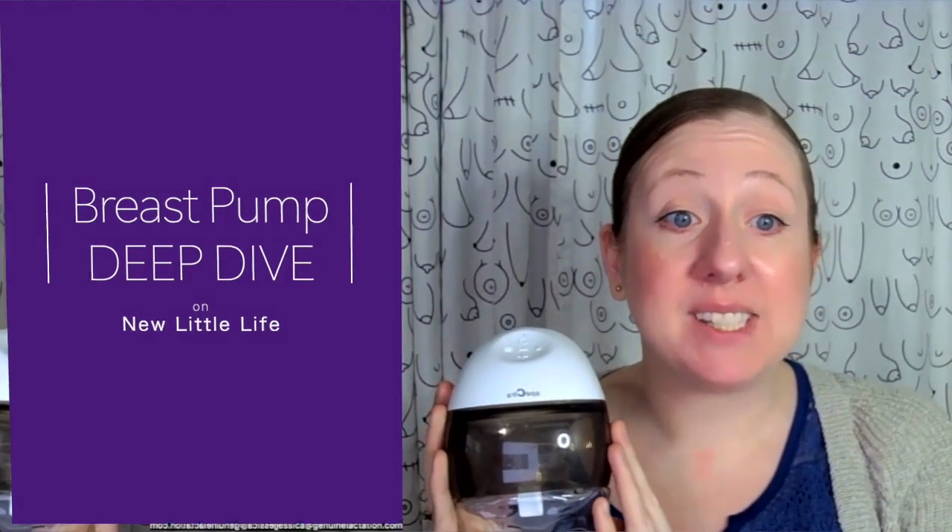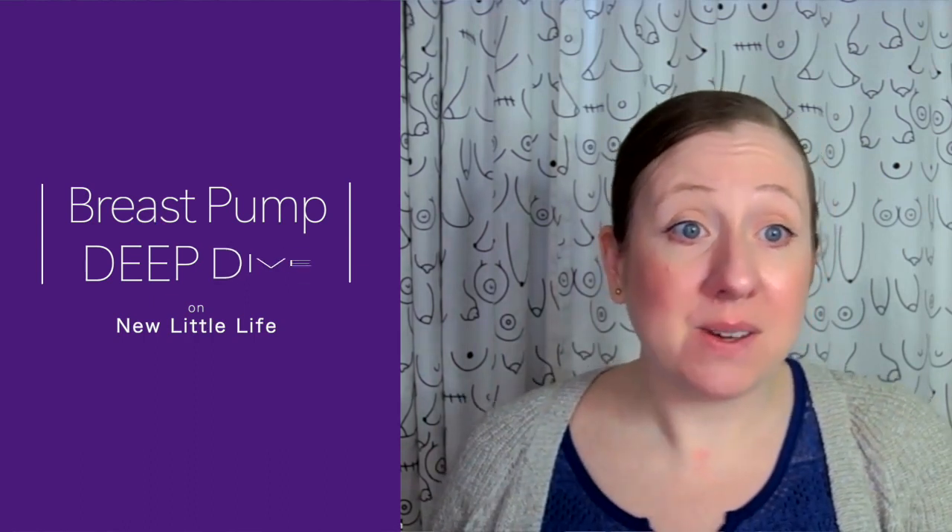Hey guys, Jessica here. So today I want to talk to you about the Spectre wearable. This pump has been on the market for several years. It's been imported into the U.S. for quite a few years now. However, I did just see that it got FDA approval here in the U.S., so I would expect this to hit the U.S. market really soon.